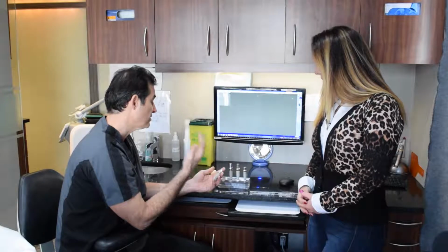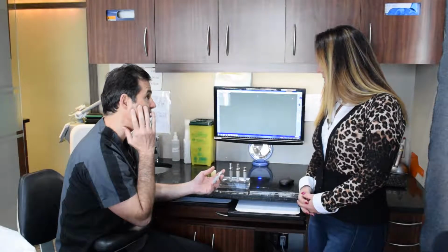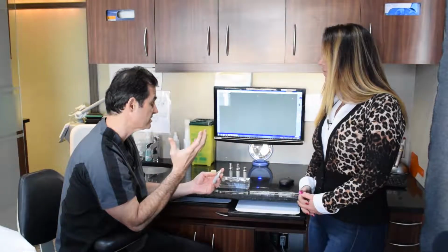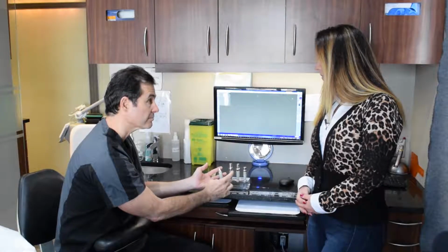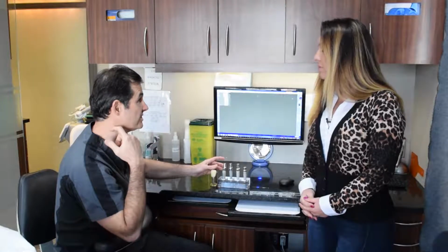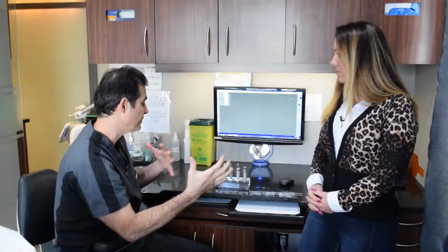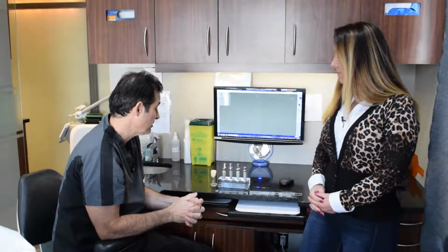Because you're right, the bone in our mouth is not the same. On the upper, at the back, the bone is very weak. It's not very dense, so we might want something like this that has wider platforms. On the lower anterior, the bone is very, very dense. It's like drilling into concrete sometimes. Depending on the bone density, we might use a different shape, different lengths, those kind of things. But in a nutshell, an implant is just a screw. That's all it is.